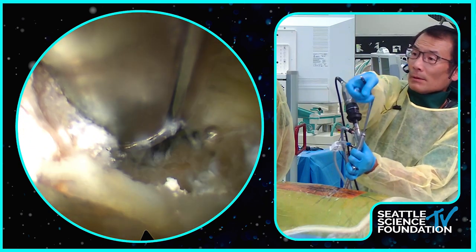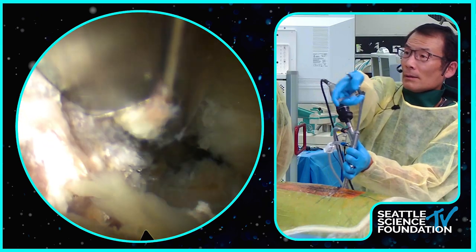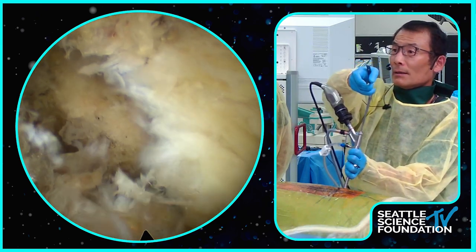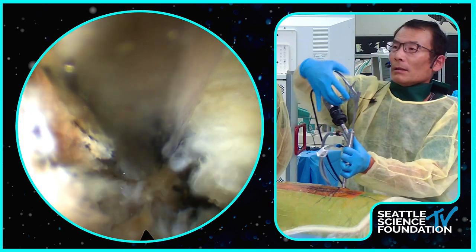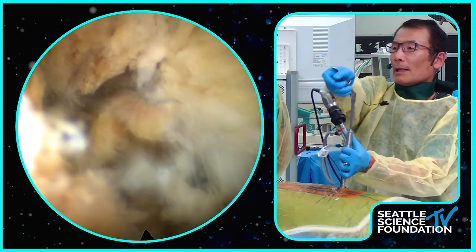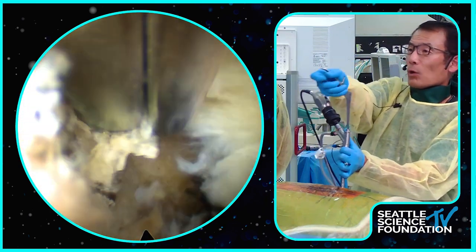So what did you start doing? The first thing you see is the facet joint, and then you start going straight through the facet joint. What are you doing to create this large area of decompression? Actually, I start medially, from the midline, and work my way laterally.